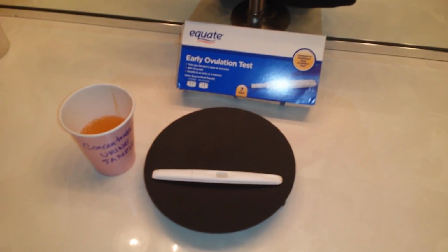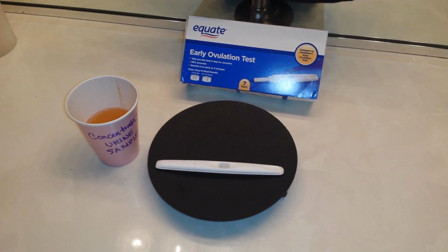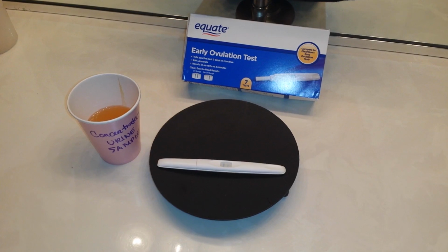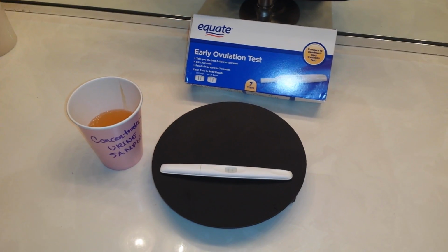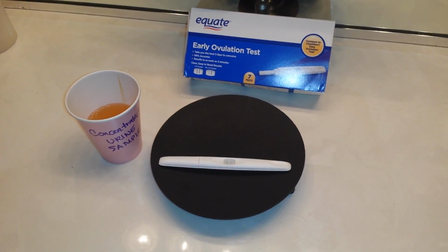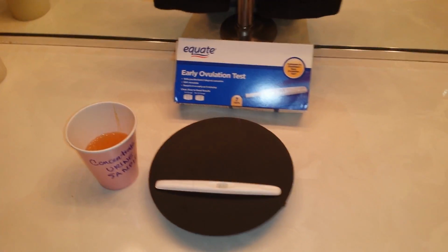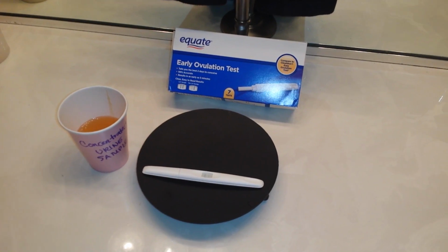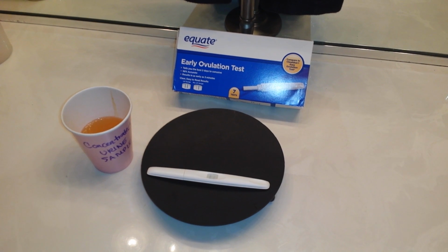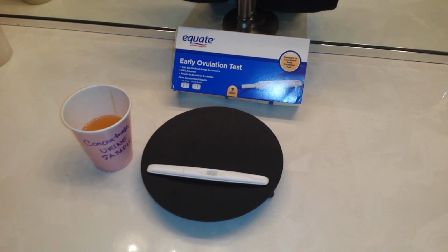I've read some reviews where people have said that they're very hard to read. And that's true enough, because I've taken other ovulation tests, even pregnancy tests, where the line is very vivid. It's very thick, regardless of what the color might be. These tests, I'm not very impressed with at all. Although I can tell that, yes, that is indeed a positive so far, the test line is darker. But had it been the same color, that would be kind of iffy. Is this a true positive? Is this a negative? The transparency of the lines makes it very difficult to read.